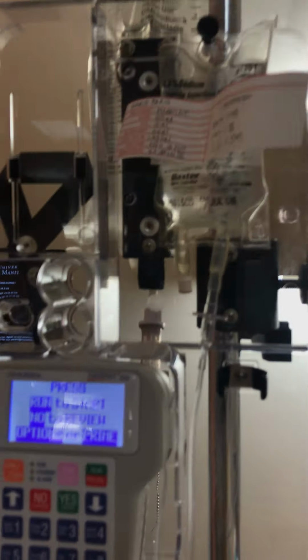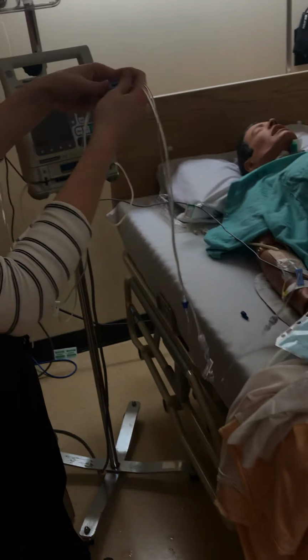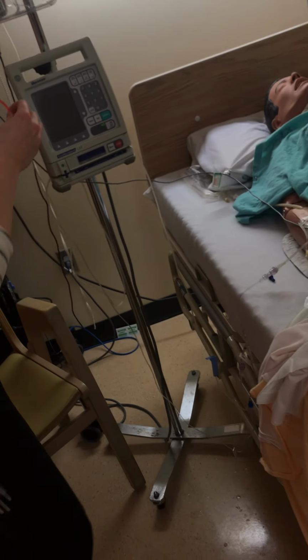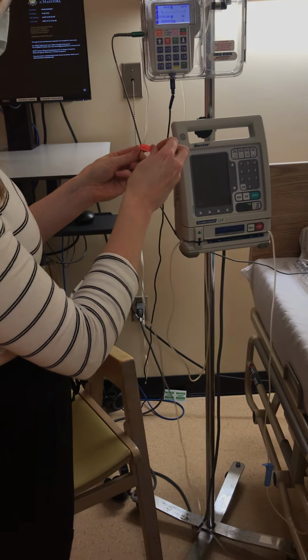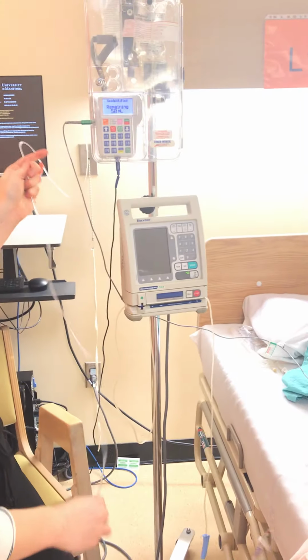I'm double checking that all my clamps are unlocked. The normal saline clamp is unlocked. This clamp is unlocked, so there's nothing in the way. I'm going to put this label on this line. This label says morphine, it says the date, and it says the time. And that's an identifier, just so they know what's running.